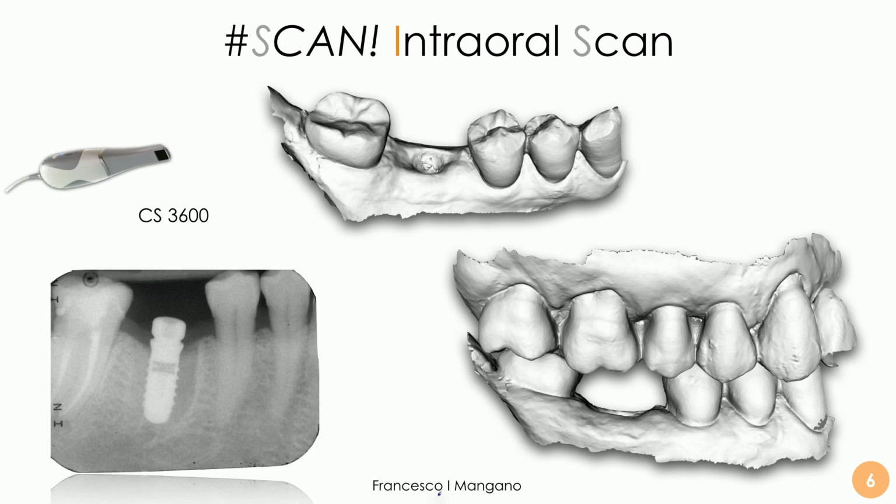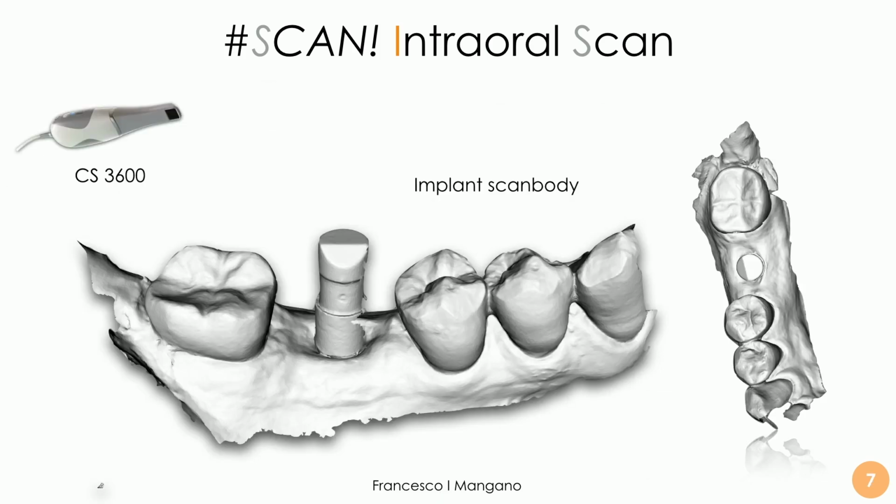So this is the intraoral scan from the very beginning of our prosthetic restoration. There's an implant in place, already integrated. We capture our scan before we remove the healing abutment, and we capture the scan of the mucosal collar, the master model, the antagonist, and the bite. For a hemi-arch, we can simply scan the bite of the hemi-arch a couple of times and it's more than sufficient. And then we place the scan body in position and we scan the scan body.